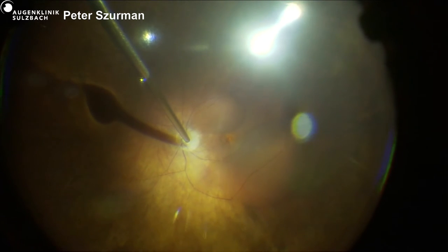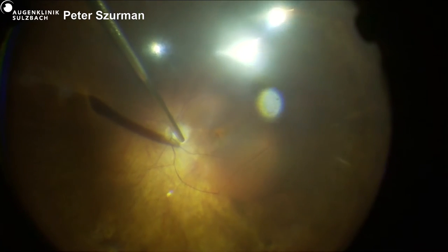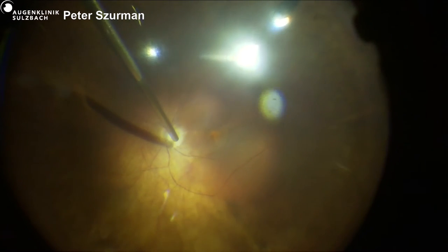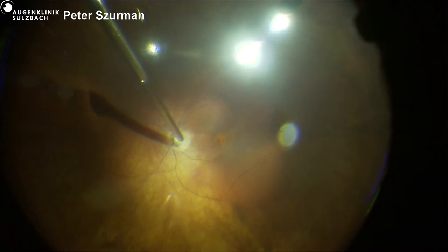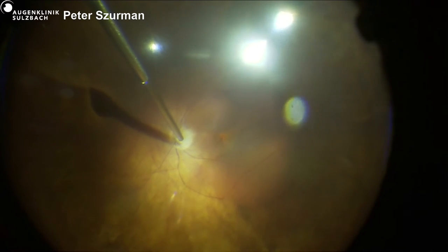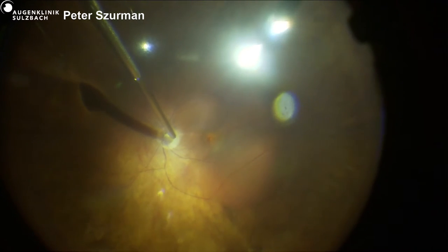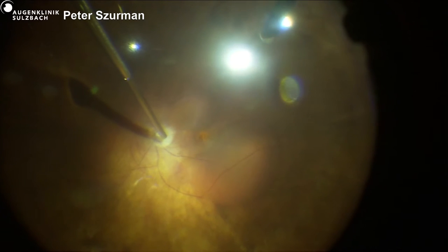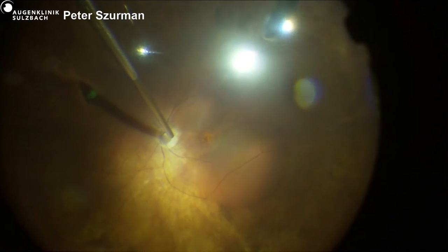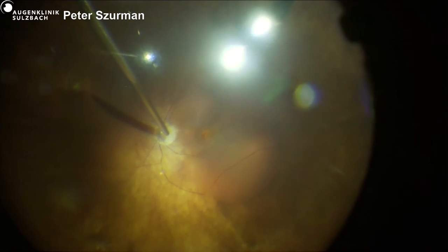Peter, I have a question. Why did you put that small PFCL bubble in at the beginning? What role does that play? A very good question. Basically, we don't want that the blebs join in the fovea until the last bleb is formed. Once the fluid is broken through the fovea, because the edges are dissolved, then you cannot continue with bleb formation. The surgery is over, basically, and you must be satisfied with, for example, one bleb. So first I do the bleb formation.